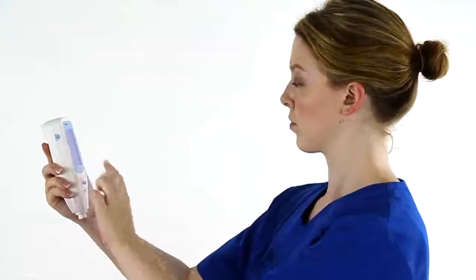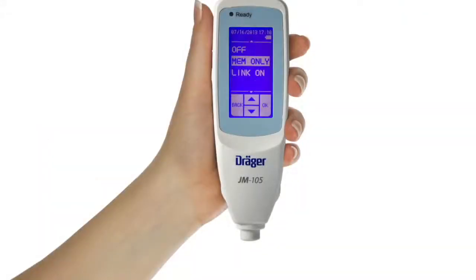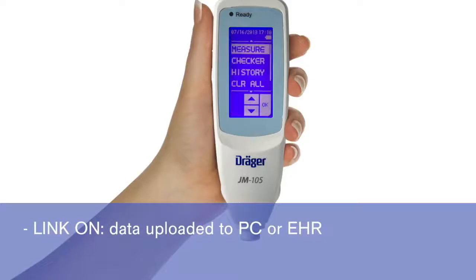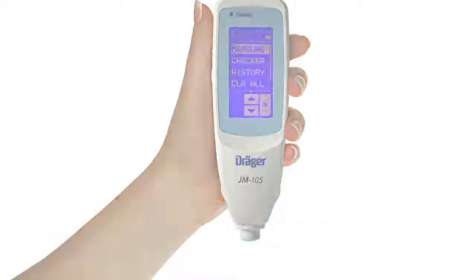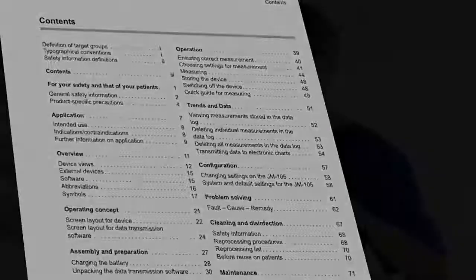If you want the JM105 to store the measurements taken, you must select either Memory Only or Link On. If you select Memory Only, the device will store the measurements taken. Link On is selected when the JM105 will be set up to transfer data to an electronic health record or computer. Refer to the instructions for use for more information on using this feature.